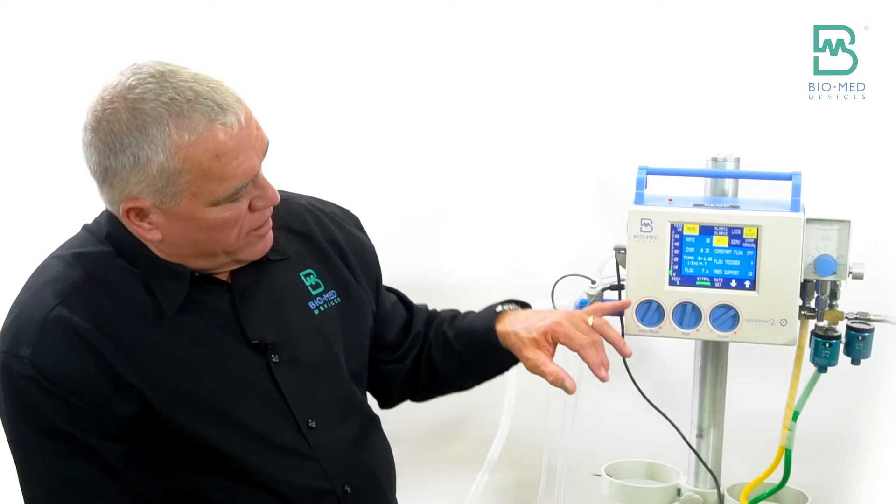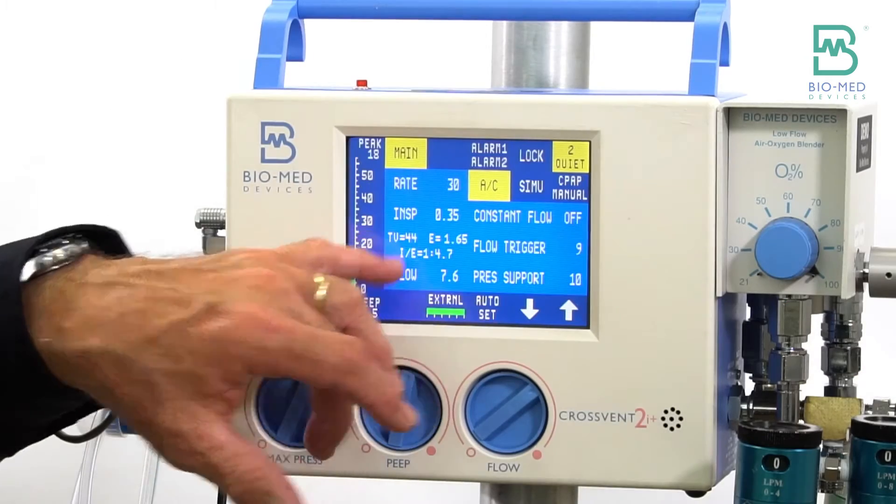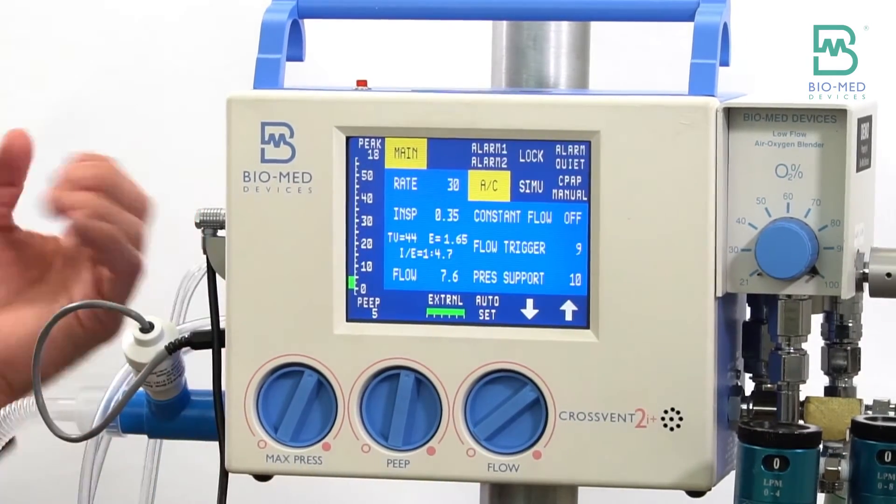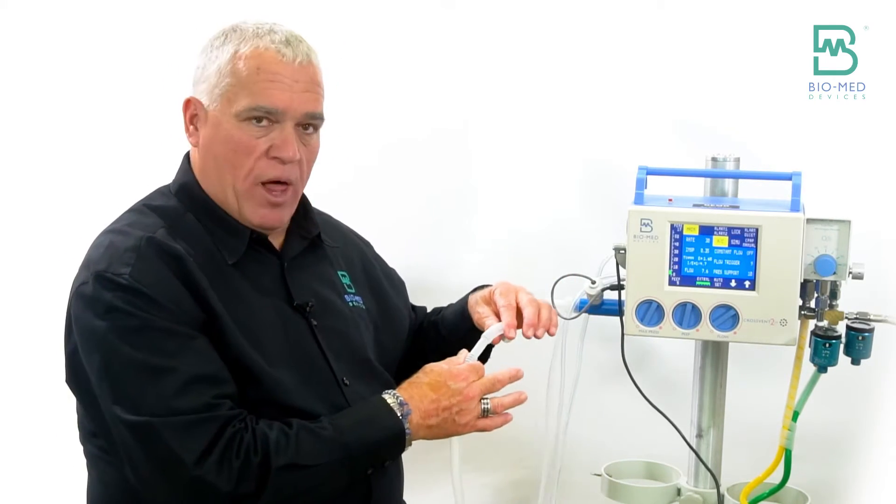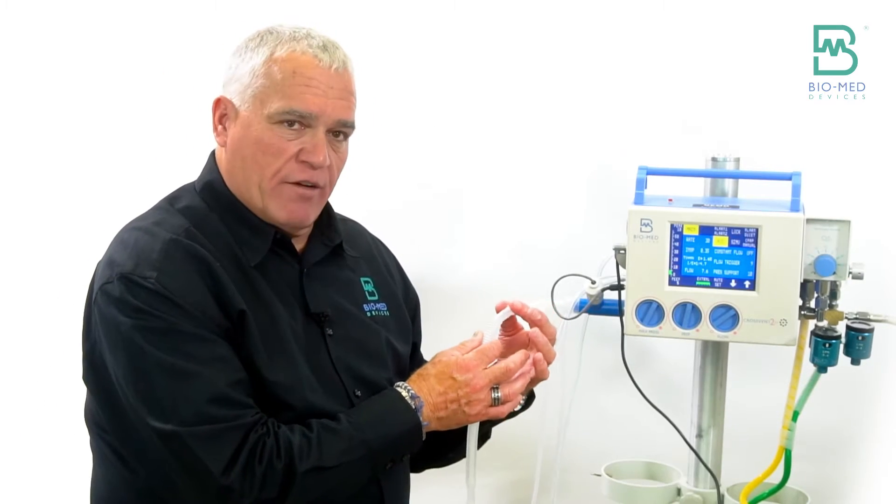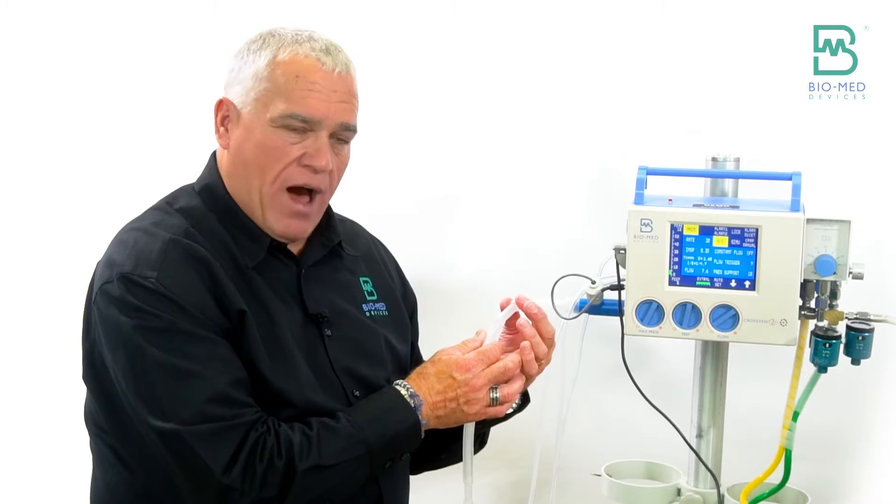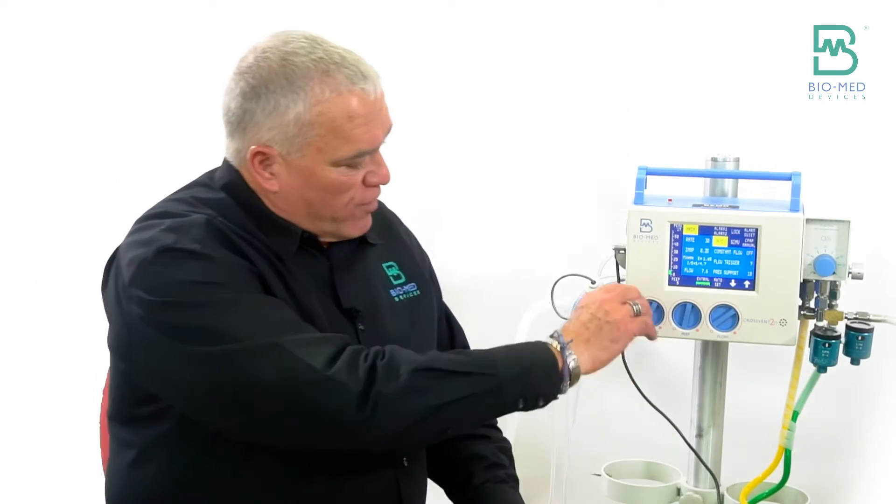So this 44 here is the total number leaving the vent, so what I have to take away from that is how much volume I'm gonna lose in the circuit compliance. Well, our circuit has a compliance factor of about 0.5.